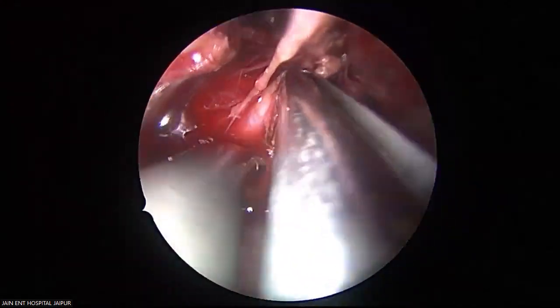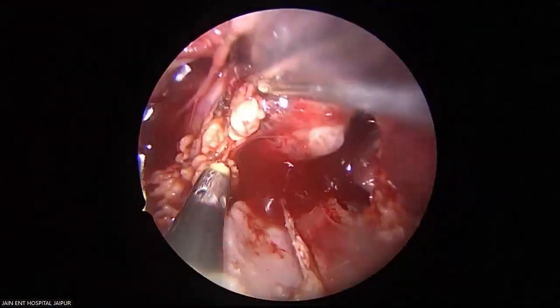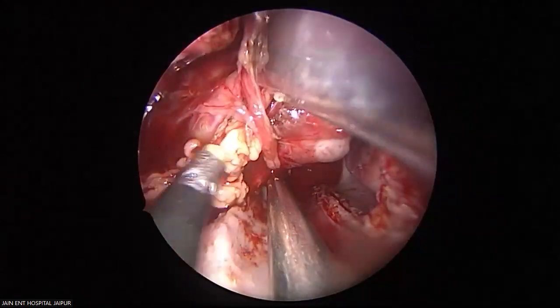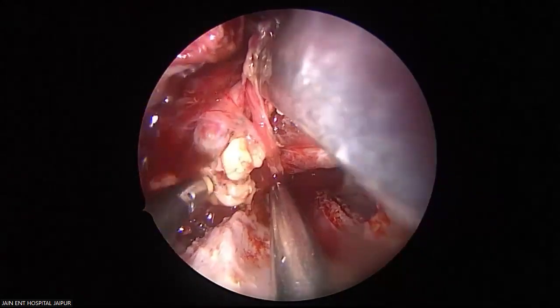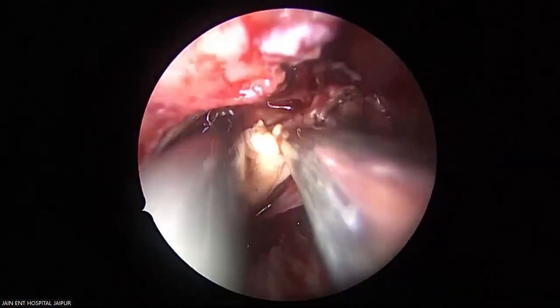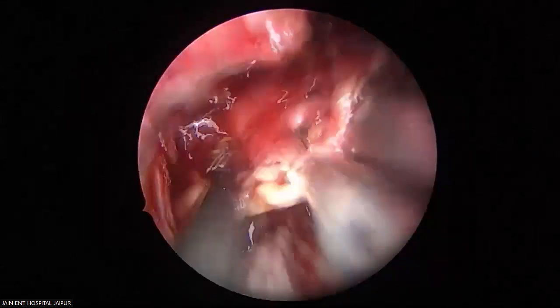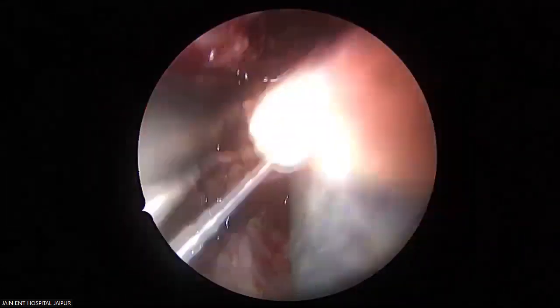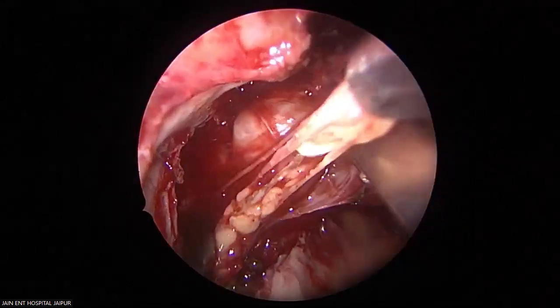We are cleaning the surface. Everywhere, just clean the surface of anything other than tumor. See this?